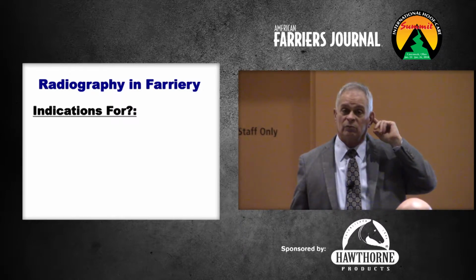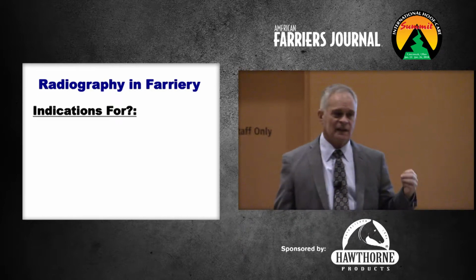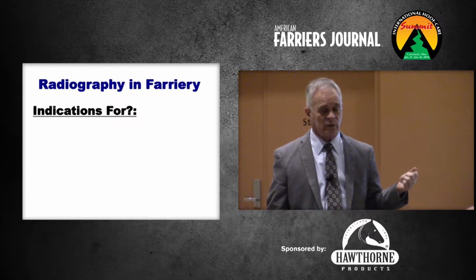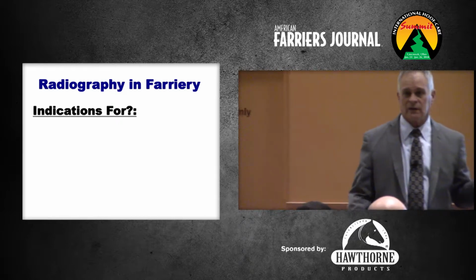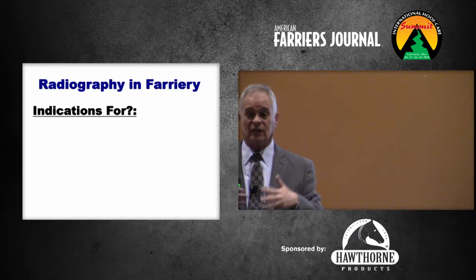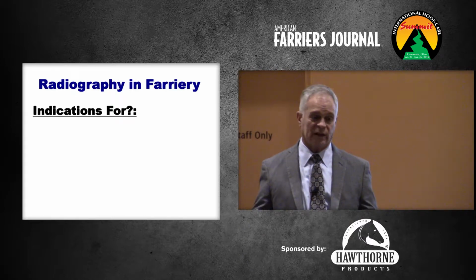Okay, so I think the suggestion was the laminitic founder pony. Let's just say chronic laminitis. That is one of the most common cases that we see at Virginia Tech, and we use radiography to help ourselves work with those horses. We not only evaluate bone health in those horses, but position of the distal phalanx or coffin bone within the hoof capsule. In these cases, alignment of the hoof capsule and the distal phalanx is important, because they can get away from the farrier very easily since they don't grow like a normal foot.